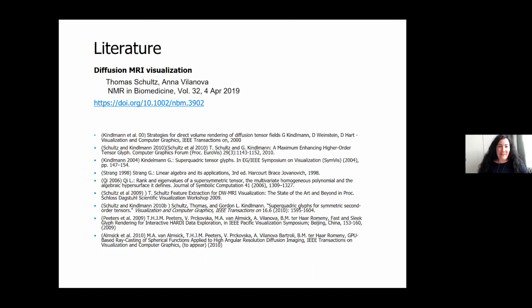Okay. So the first question that we have here is how regular is the typical measured tensor field? Is any kind of a denoising step necessary before tracking the fibers? Yeah, in general, when you do the model, right? So when we do the acquisition in different directions, if you want to have a tensor, you just will need 6 directions of acquisition. But actually, in practice, you acquire many more directions. And when you are actually fitting your tensor, you are kind of already applying a denoising.